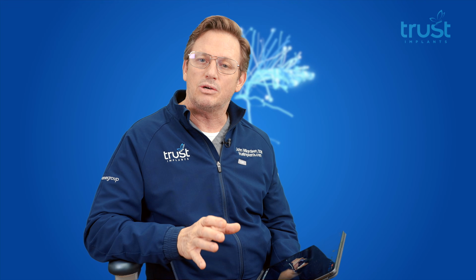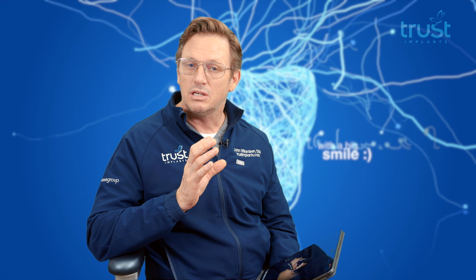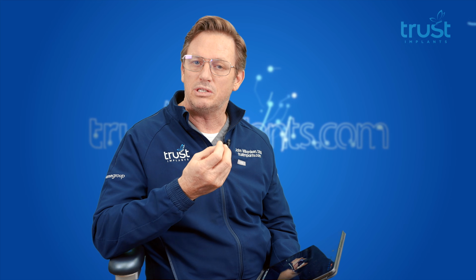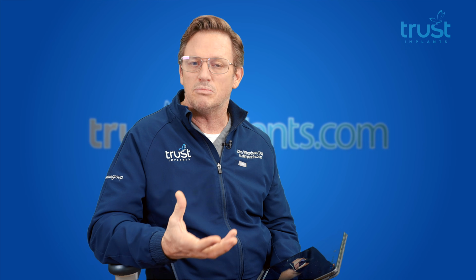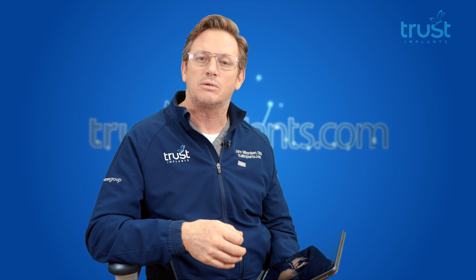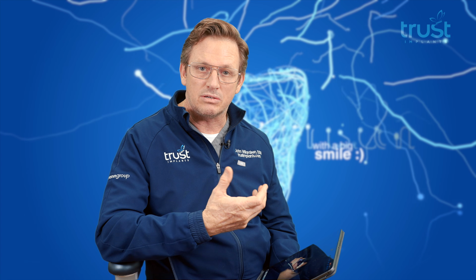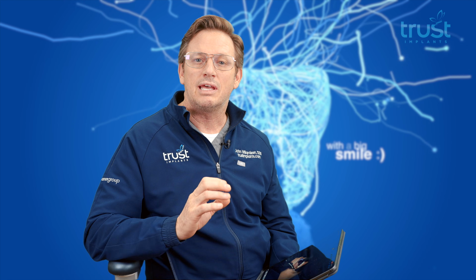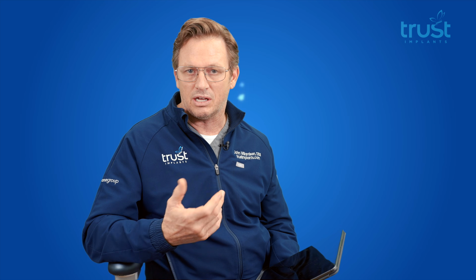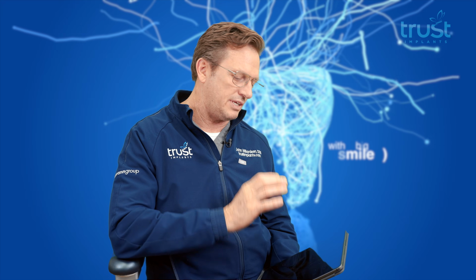So I'd like to show a case today where we do just that, where the tooth had fractured at the gum line, so it's non-restorable. We remove the tooth and the remaining roots, then prepare the osteotomy, or the hole where the implant needs to go, graft around the defects that are there, and then prepare the final osteotomy via osteotomes, and then place the implant. So let's take a look at the video here.